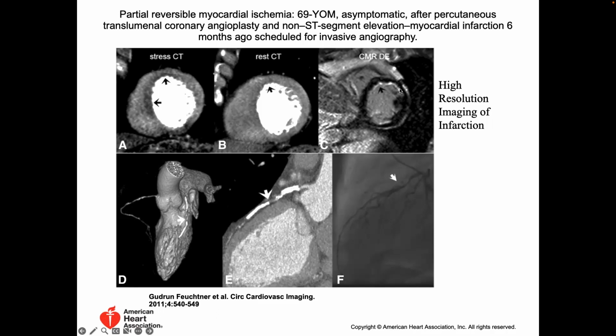So this patient has this thin film of infarcted tissue just on their endocardium, which to me is kind of strange, because you would imagine that all of this blood right here is highly oxygenated. So why is it not at least diffusing into the myocardium? But it probably is at some level. Maybe this really dark rim here is still viable tissue, right?